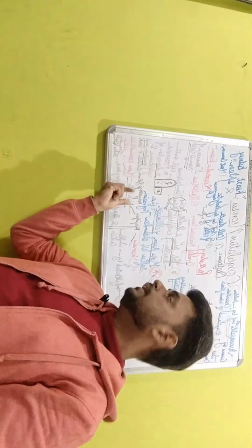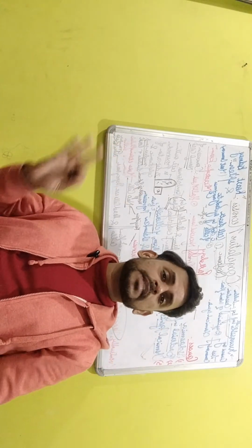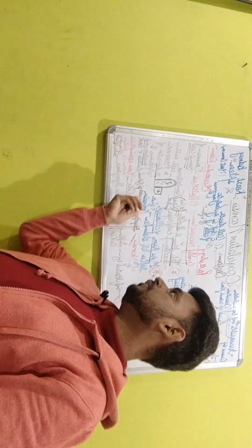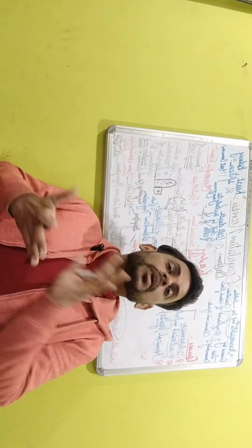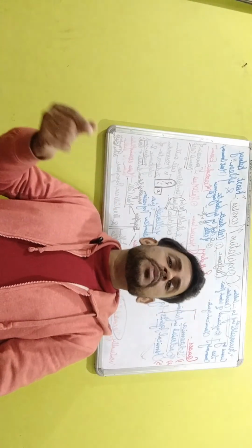Along with this, the necrotic cells are going to show three important characteristics when it comes to the nucleus. The nucleus shows karyolysis, meaning there is dissolution of the nucleus with the nuclear chromatin material. There can be karyorrhexis, meaning the chromatin material in the nucleus is going to fragment and disintegrate into smaller pieces.